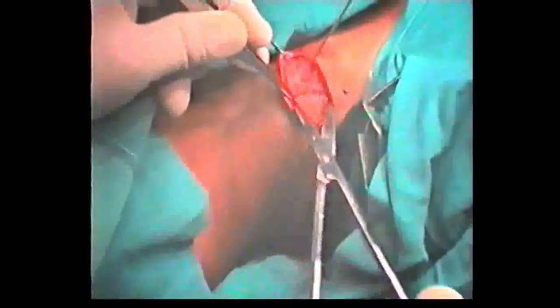These branchial anomalies are usually seen in the young, but sometimes the symptoms develop in the elderly. There you see the cyst being dissected. Here also you can see the dye which has been injected there.